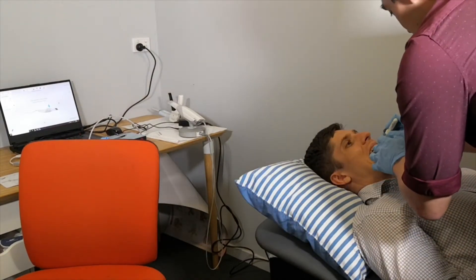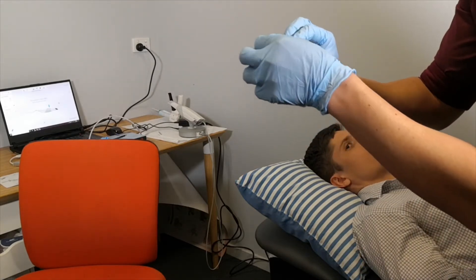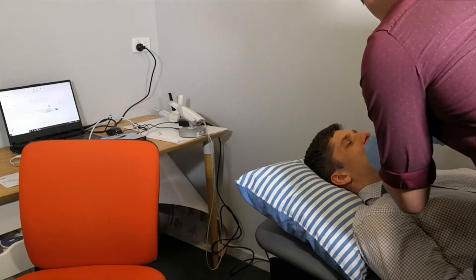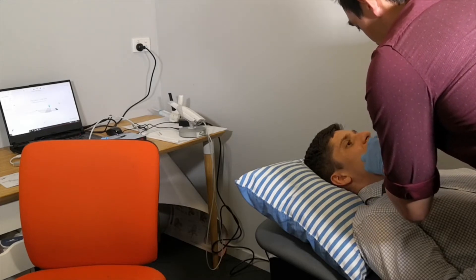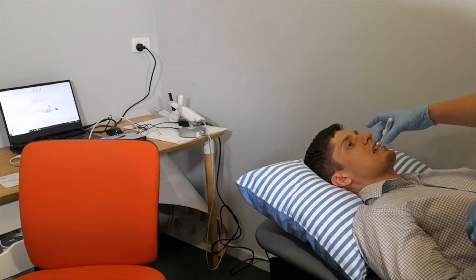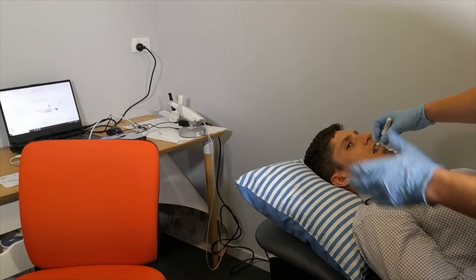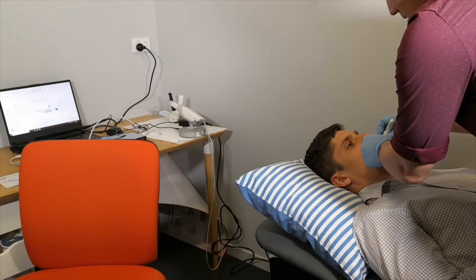I'm just going to get Callum to open up again. We also have the vertical ramp, which we're going to leave loose for the time being. We're just going to get Callum to bite down together into that groove. So now he's biting into it — just keep biting on that. We can move the vertical adjustment ramp on the top forwards and backwards. We want to bring it as far forwards as possible so that it contacts the palatal aspect of the upper anteriors. We'll tighten that up now so that it's nice and tight and resting on that well.